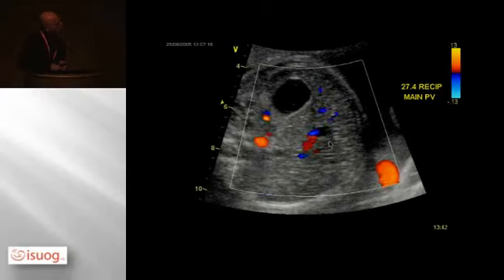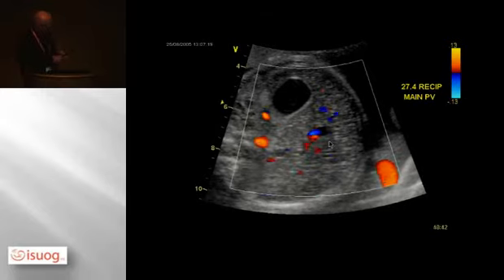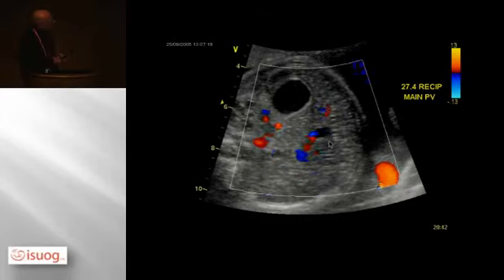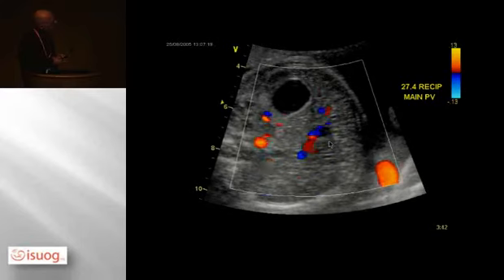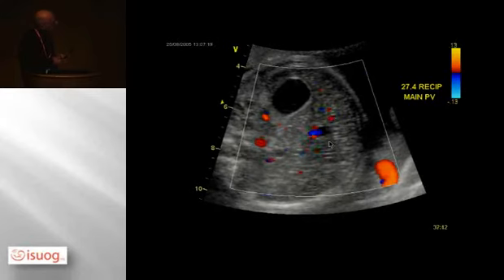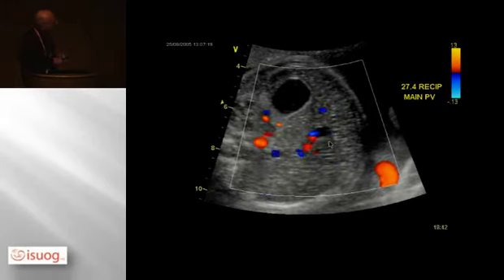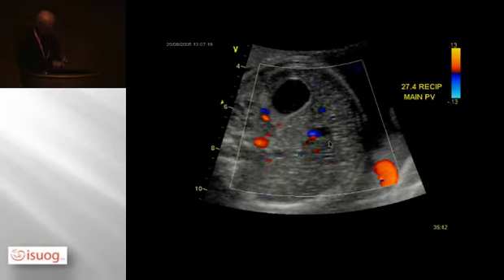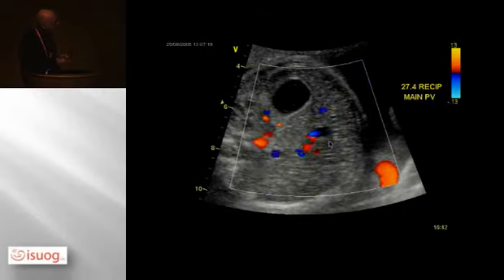Look at this. This is not normal anymore. This is a fetus. You see the stomach here. This is the umbilical vein. The ductus venosus is going off here. This is the left portal vein. The blood should have gone from the umbilical vein down here into the right side. The portal stem comes here, but it's on a slightly different level, so you can't see it. But the red blood here tells you that there is blood going in the opposite direction in this fetus than we would expect. It should have been oxygenated blood going from here down here, and it's the other way around.